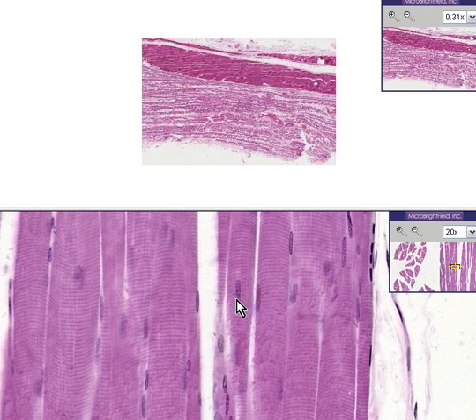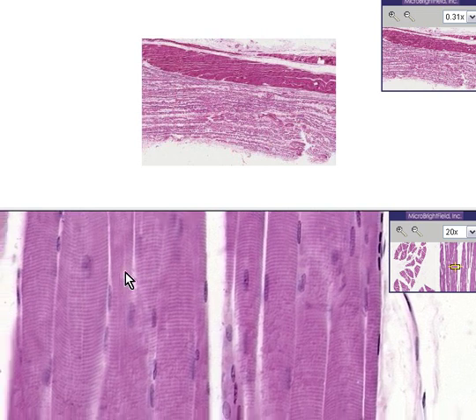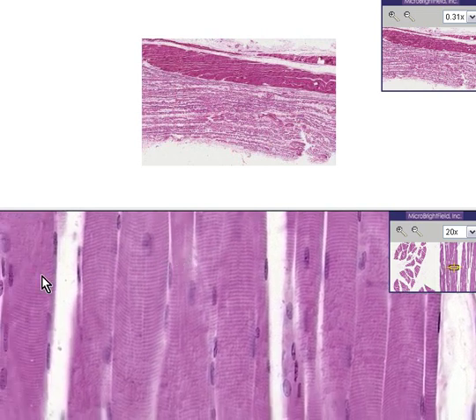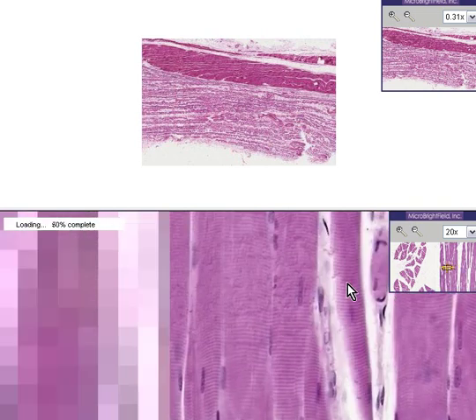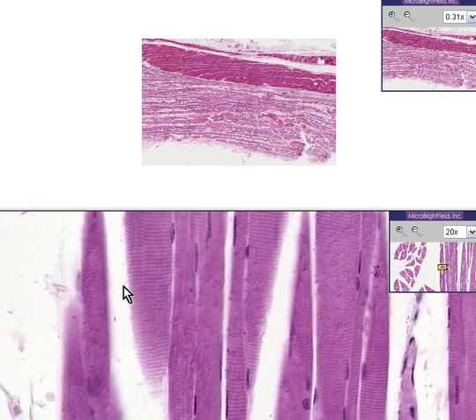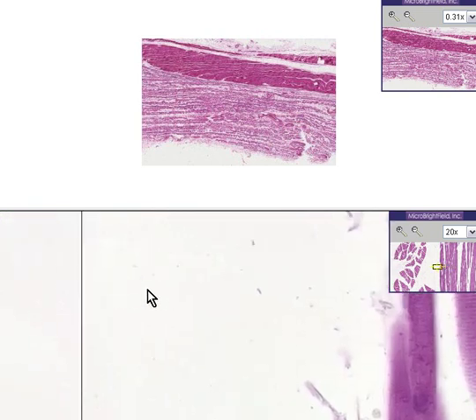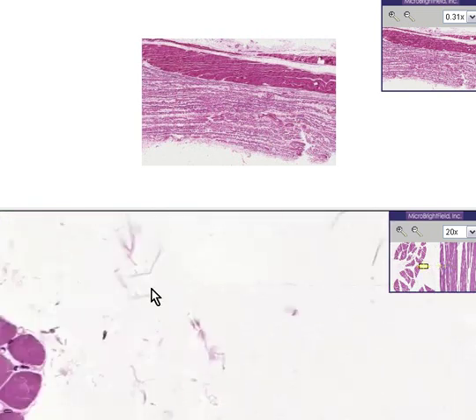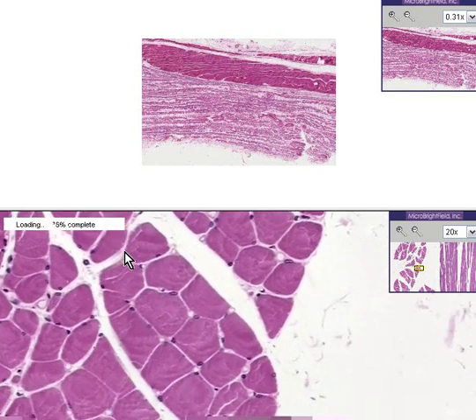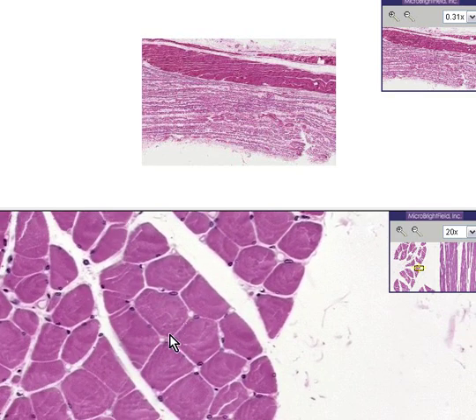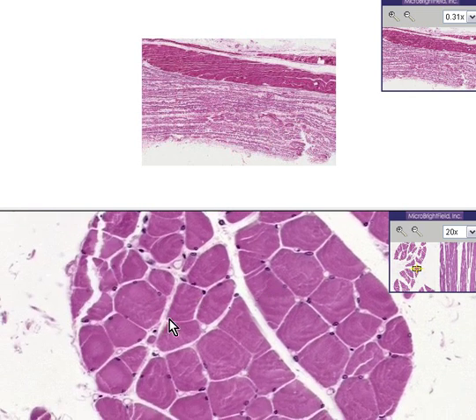If some nuclei look like they're in the middle of the fiber, it's probably because the fiber has been cut tangentially. Here is that same group of skeletal muscle fibers now cut in cross-section rather than longitudinal, and notice that all of the nuclei are at the periphery — none are in the middle.